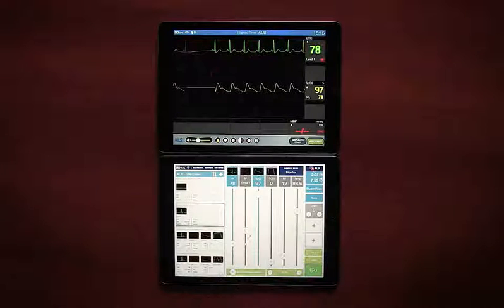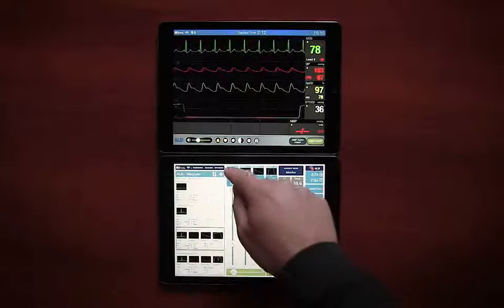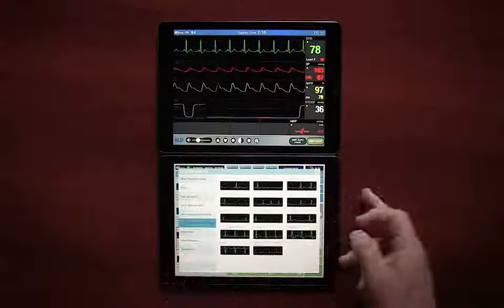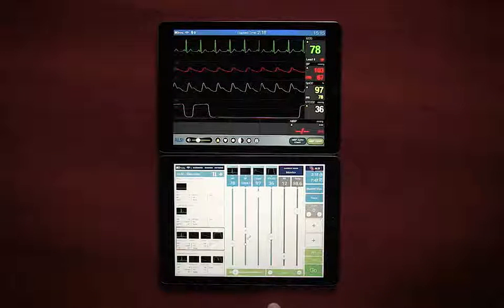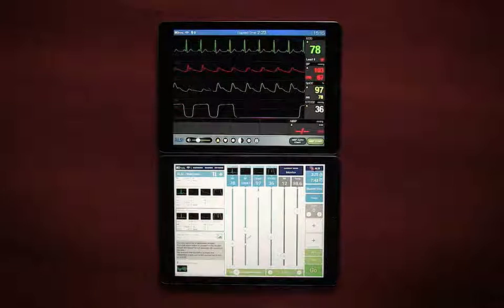As we continue to build on the case, we can bring in our art line and our end-tidal CO2. At any time, the instructor can bring in one of almost 70 different heart rhythms on the fly by grabbing it and pressing go. We've also pre-programmed some slight changes here in the next box.